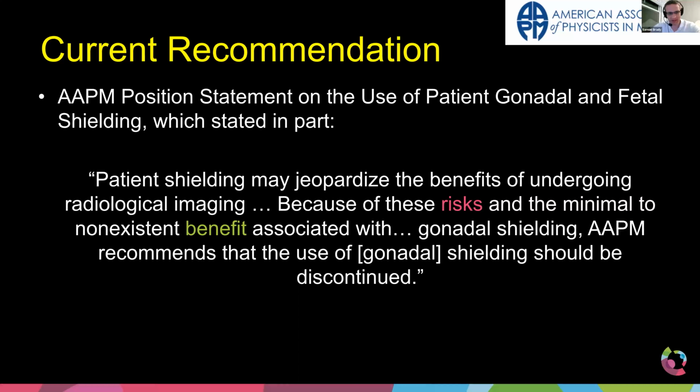And in part, it states patient shielding may jeopardize the benefits of undergoing radiological imaging. Because of these risks and the minimal to non-existent benefit associated with gonadal shielding, AAPM recommends that the use of gonadal shielding should be discontinued. So there's two things in here I highlighted in color. The first is the use of shielding doesn't really provide benefit anymore or at all. And we'll talk about that in a minute.